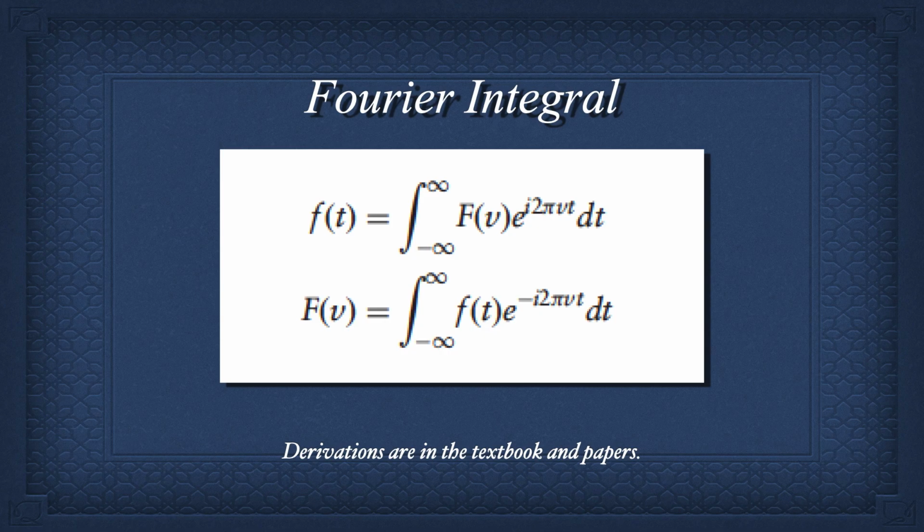a sinusoidal wave, a Gaussian wave, a Poisson wave or pulse, then there's a certain set of frequencies, which is what capital F of v, the v being the frequency distribution for our purposes here, would give to us. And the reverse holds.